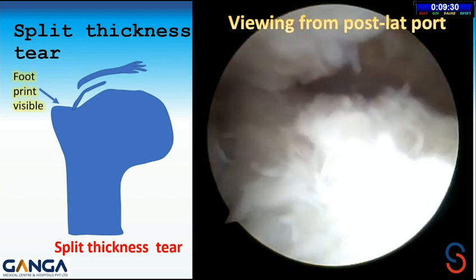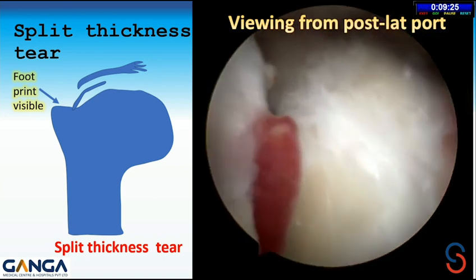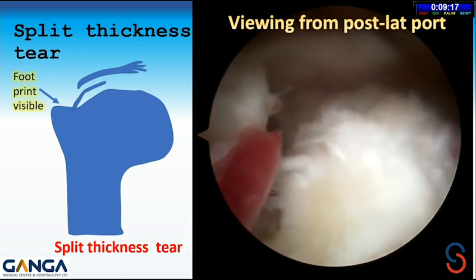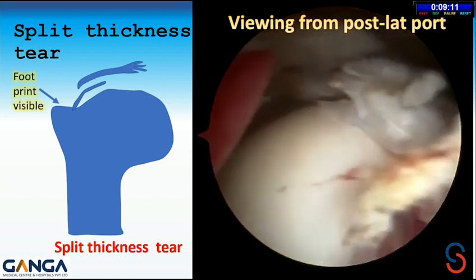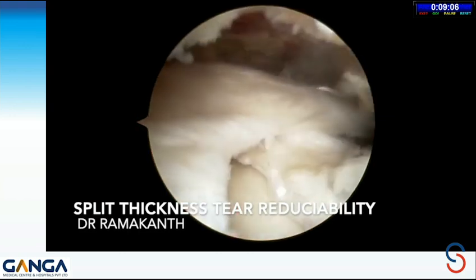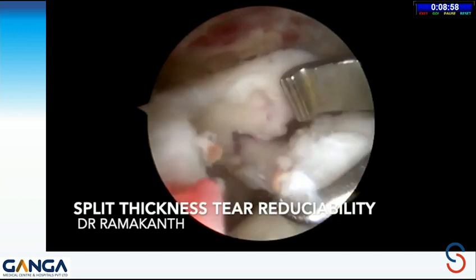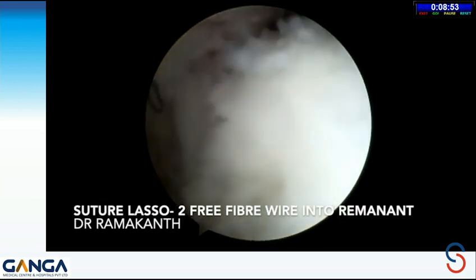This is the picture where we can see that the distal stump is still there with the greater tuberosity, and we can see the bare area of the footprint, the bone area. That shows that it's a split thickness tear, which is not classified. What I've done is taken just a fiber wire. This is checking the reducibility of the cuff over the split thickness portion. These are important collagen tissue, and of course this draws a blood supply from the greater tuberosity, and it is thick and large, so better to preserve it.